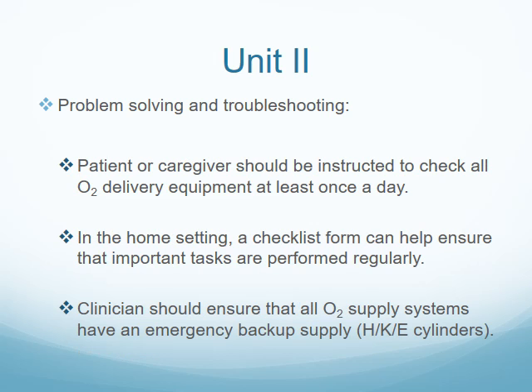With the instructions that you're going to give, you're going to inform the patient or caregiver that they should check all O2 delivery equipment at least once a day. In the home setting, a checklist form can help ensure that the patient's important tasks are performed regularly. And that's if you're one of the techs or staff that are working in a home care setting.